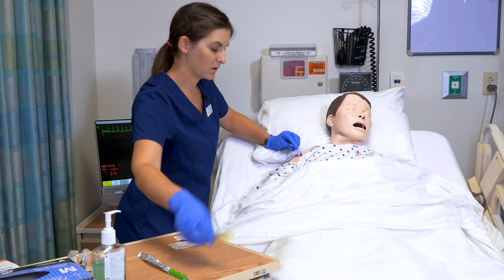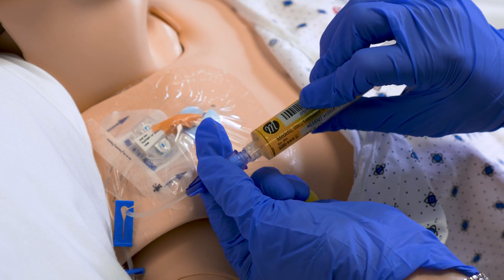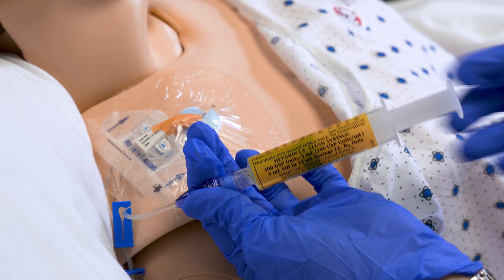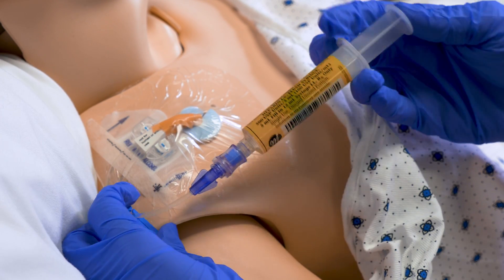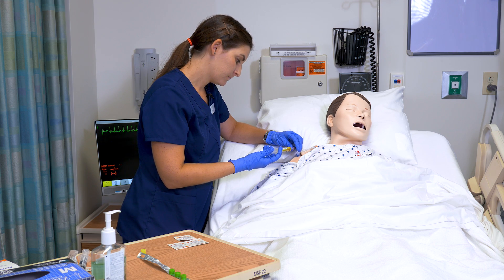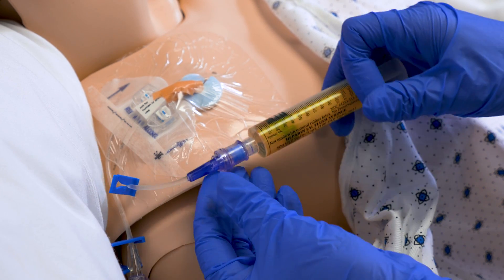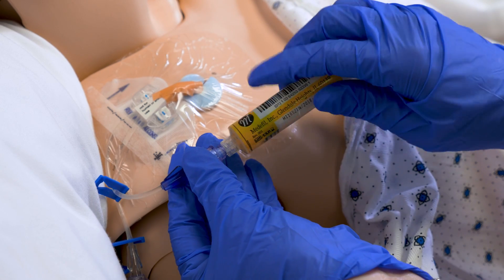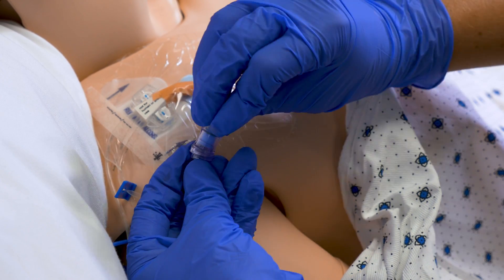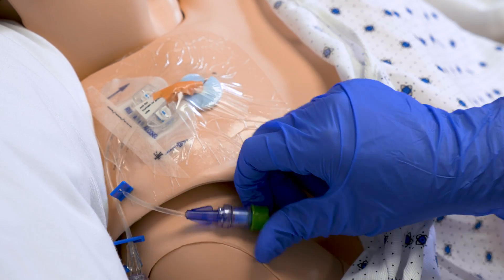This type of central line does require a heparin lock of 3 mLs. It is a negative pressure valve, so I do need to clamp as I am flushing the remaining 1 mL of heparin. I clamp my line. I'm now going to replace my Cura's cap, and that completes my administration.